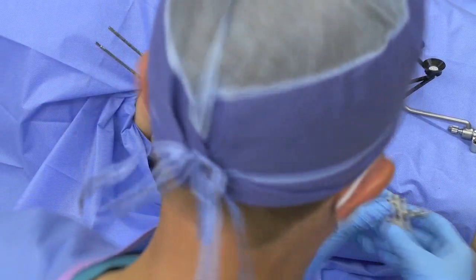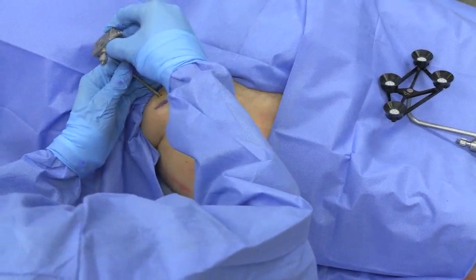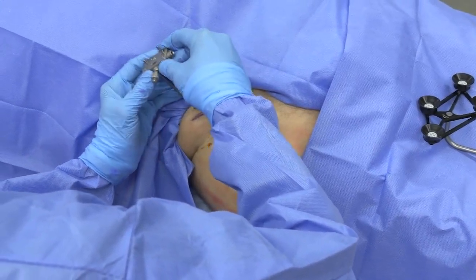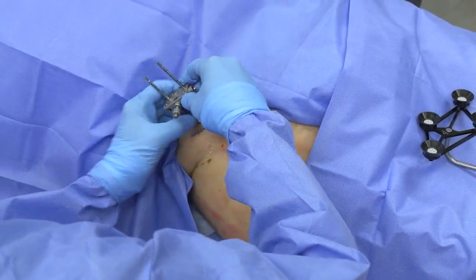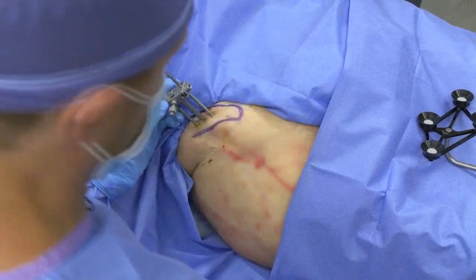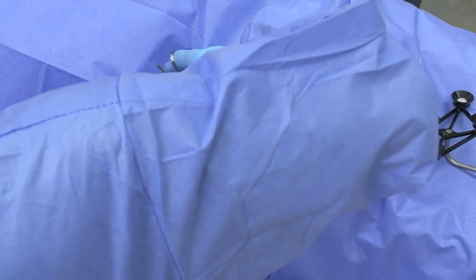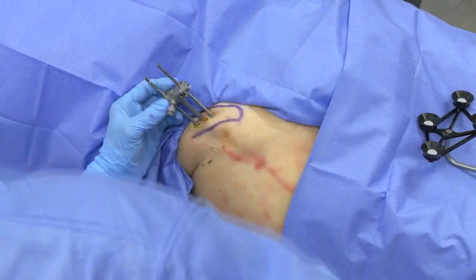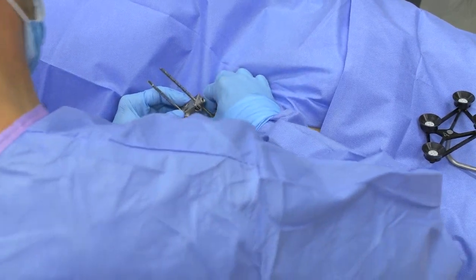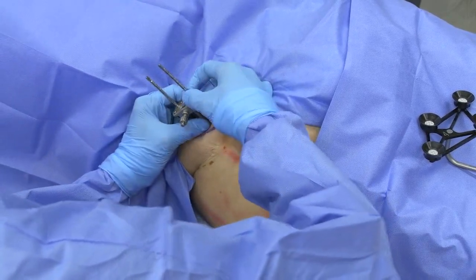Once we have our first 2 pins, we may have to broaden that central skin incision so that the tube of the drill sleeve is resting firmly on bone.